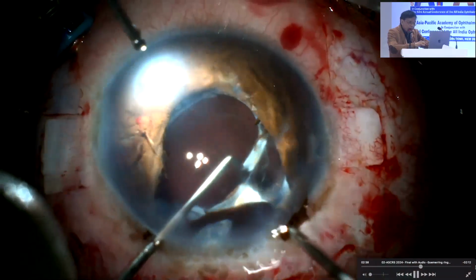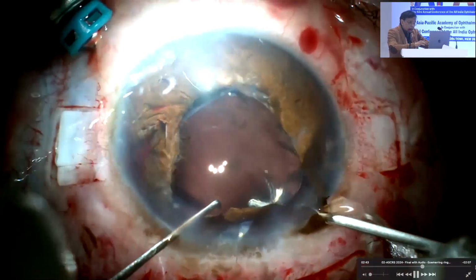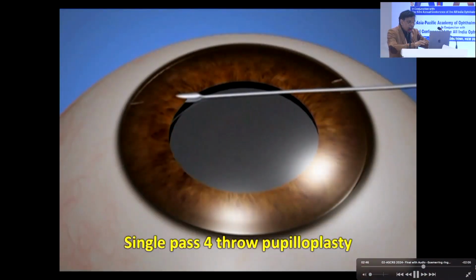And I was so happy at seeing this case. And you know, whenever I'm happy like this, things don't go well. So anyway, I try to complete this case as best as I can.